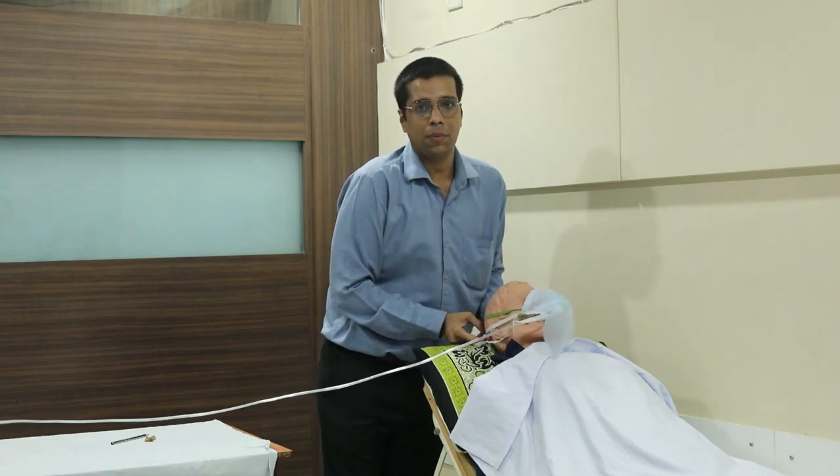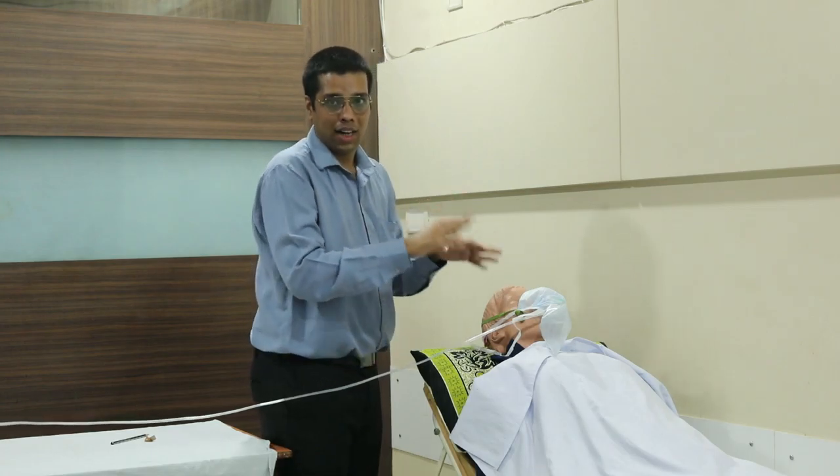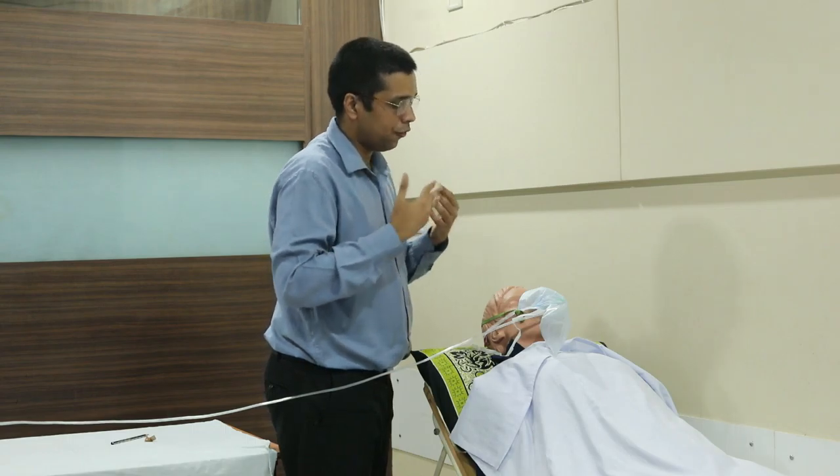This will help decrease the aerosol. After applying the mask on the patient's face, I will ask the patient, 'Are you breathing comfortably?' If yes, it indicates we have applied the NRBM properly. Since there is oxygen scarcity, when the NRBM is not in use, we have to stop the flow meter and stop the oxygen. When the patient is under NRBM, there is less chance he can move from the bed to the bathroom.